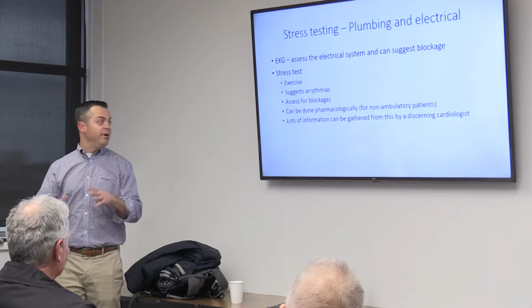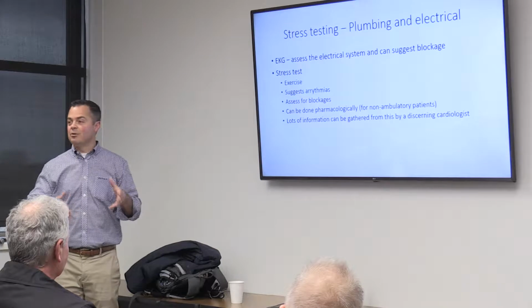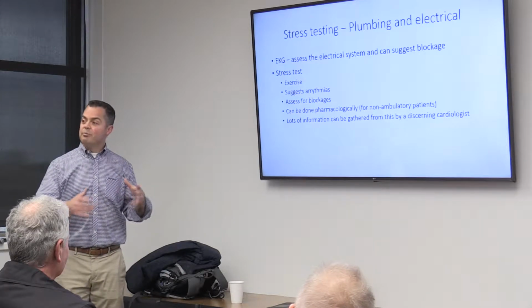Now, lots of elderly people maybe haven't been on a treadmill. It feels a little awkward. It's not as easy. I don't know if any of you remember the first time you ever got on a treadmill. It feels a little funky. But we would prefer that people exercise.